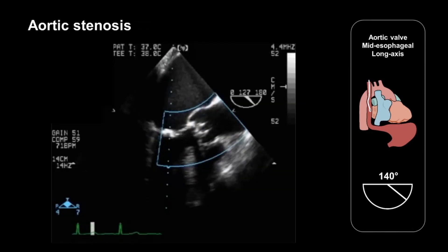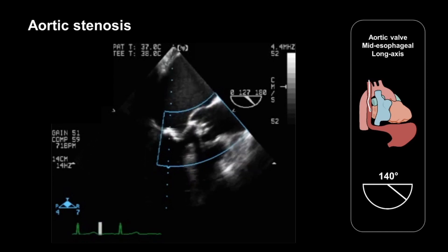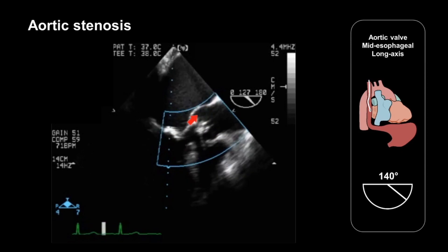Let's take a look at a couple of examples of pathology. This is a patient with severe aortic stenosis, and this mid-esophageal long axis view of the aortic valve shows thickened and calcified aortic valve cusps with greatly reduced cusp mobility.